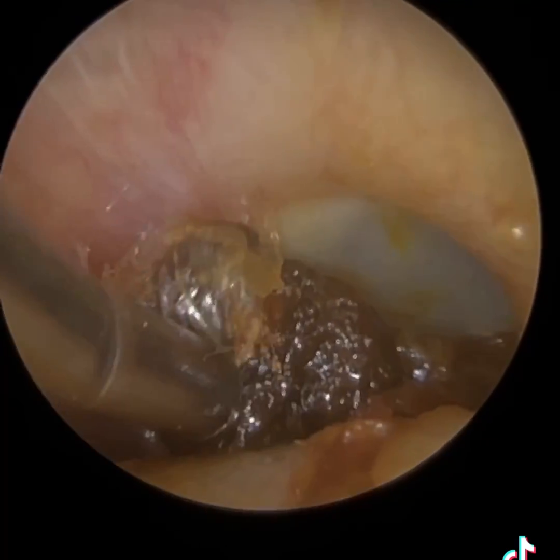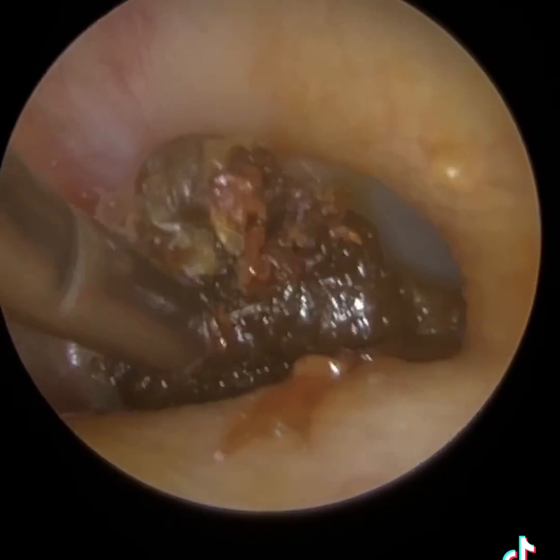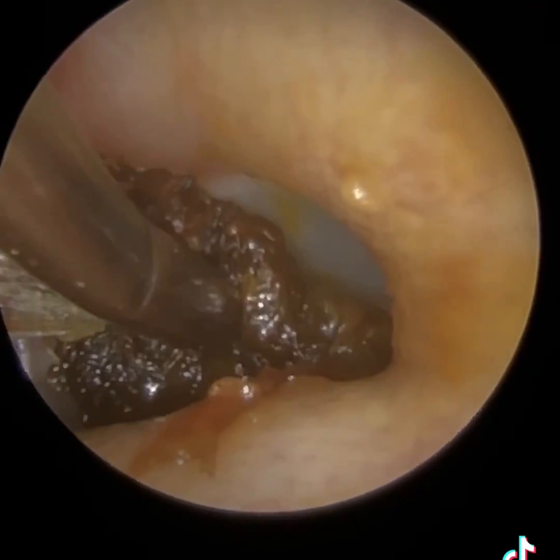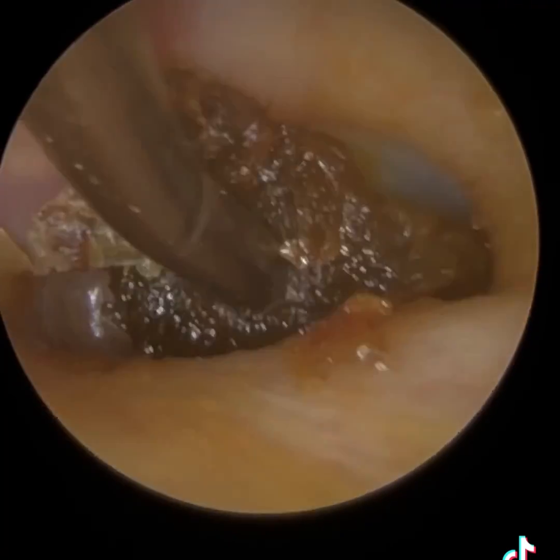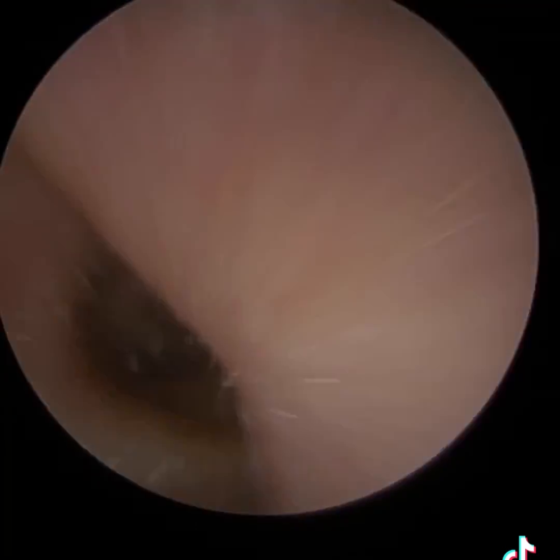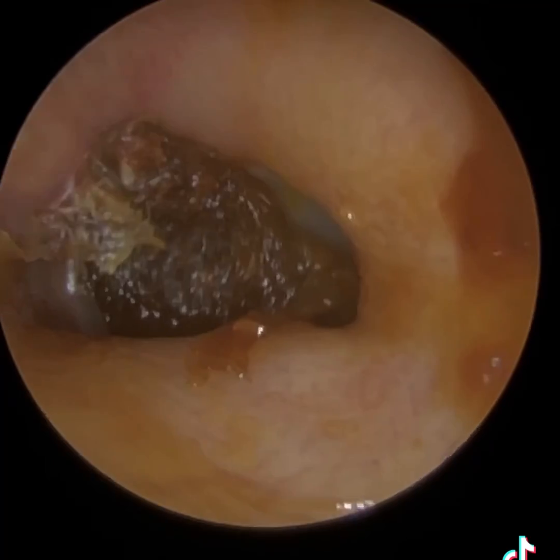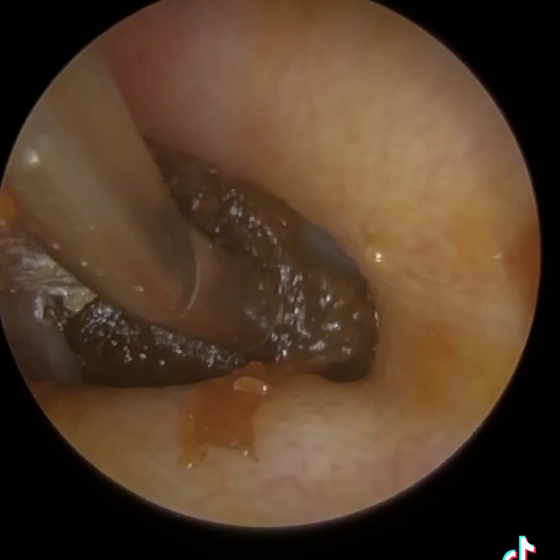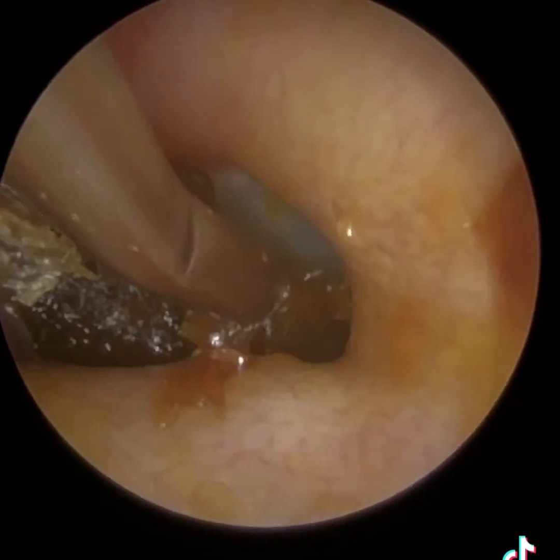As we approach the eardrum, the ear canal narrows — you may be able to visualise that — and it's about half a centimetre away from the eardrum where it narrows, and then after the narrowing the ear canal widens again. That creates an alcove to the left-hand side of the ear canal, so there's a little hidden cave there, and also a trench at the base of the ear canal, near the eardrum. You'll see in a moment, when I remove this wax plug, it's a lot larger than what it appears visually, because a lot of the wax is hidden away in both the trench and the alcove.